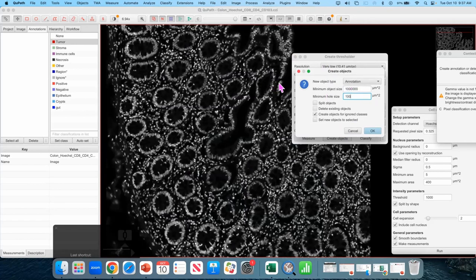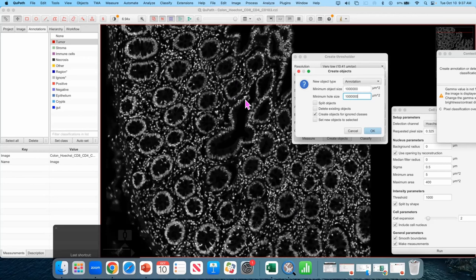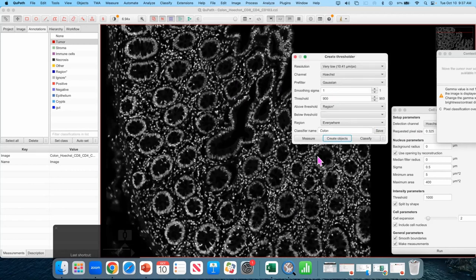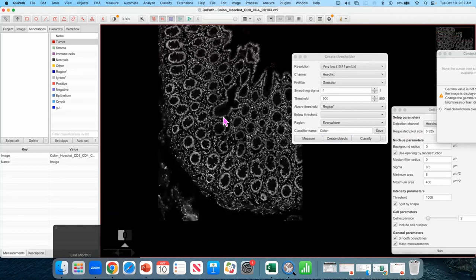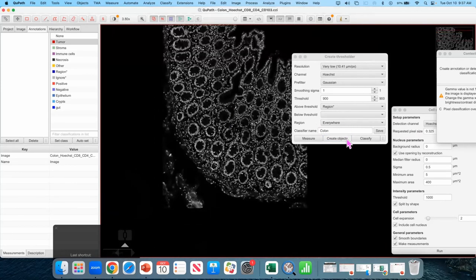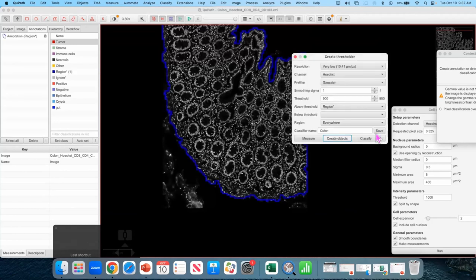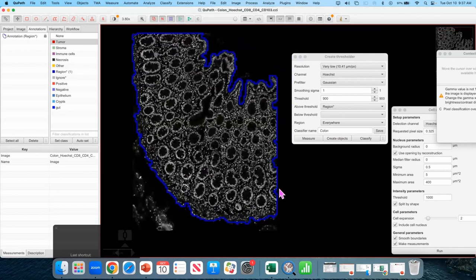Minimum object size of a million. What's on the bottom of the screen? So the lumens are you counting these lumens? Well I'm just I was suggesting to keep it standard and since the other lumens are being counted I suggest counting this one too. It depends on what you're trying to quantify. So if you're just trying to quantify tissue areas people might say that the lumen of structures whether it be the lumen of intestinal cells or the lumen of blood vessels is not relevant. But in certain disease conditions you might have a hemorrhage that's spilled over into a lumen and you might want to quantify erythrocytes and autofluorescence in the C channel. So it all depends on the biological question you want to answer.